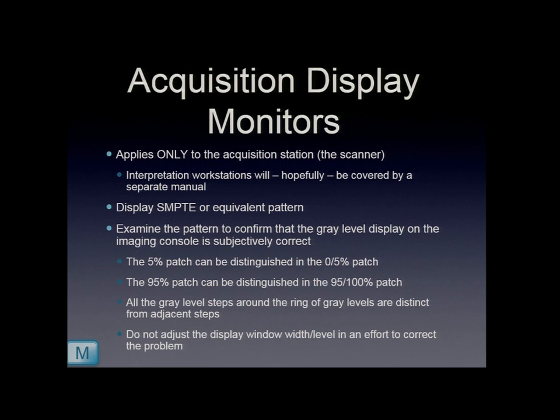Also, acquisition display monitors. This is the acquisition display, not the review workstation that is used for final interpretation. That's been deemed to be outside the realm of this, and that should be handled separately. Hopefully there'll be more guidance for that. Right now it is required for mammography. It is not required for other modalities at this time.